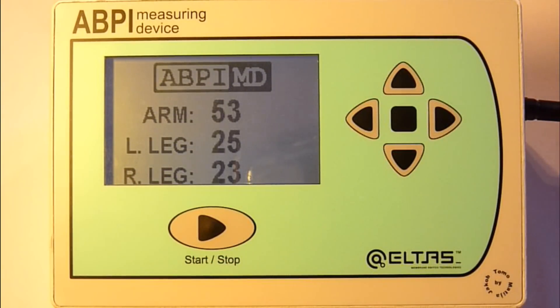Cuffs are being inflated and the pressure is shown on the screen throughout the measuring process. When the cuff pressure reaches 160 mmHg, air is slowly released from the cuffs. Meanwhile, the software algorithm filters data and computes the systolic pressure of each extremity.